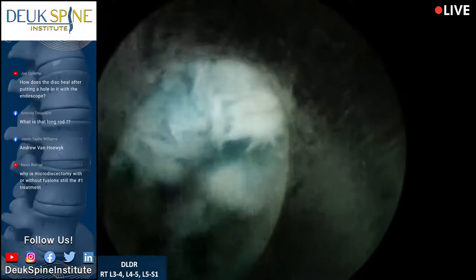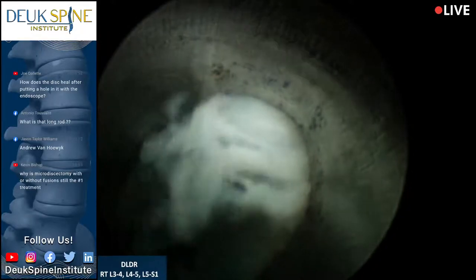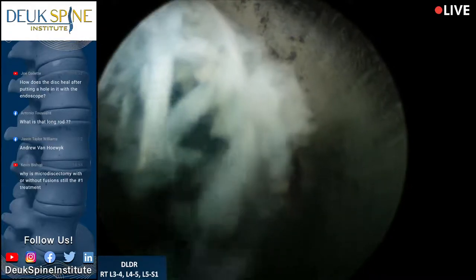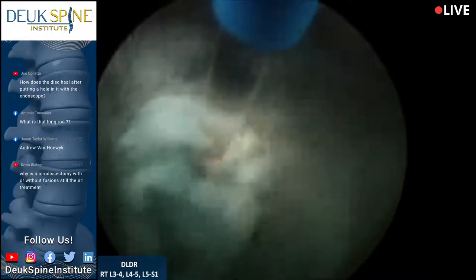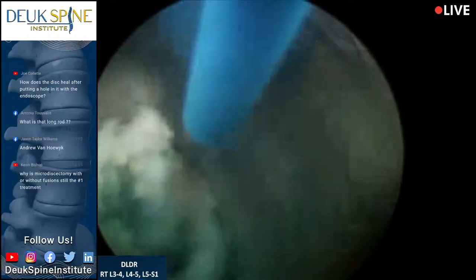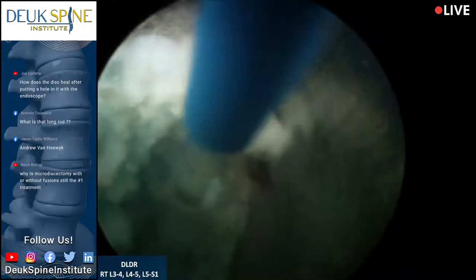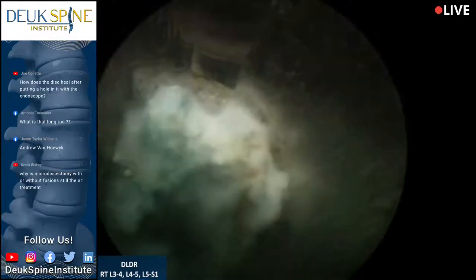Look at the tear, by the way. It's really obvious if you look here, you see the fibers of the annulus right there, and then they're frayed right there in the middle. So that's the annular tear that allowed the herniation to come out. I'm gonna go in there and clean it up. You see the blue stuff stuck here? That's the herniation stuck in the annular tear. And that's what's keeping the annulus from healing. So I'm gonna give this patient a chance now with this surgery to heal their disc properly.